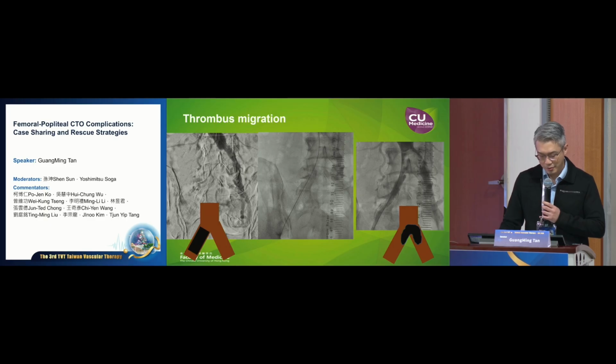Now, this is another case of an unusual embolization event.